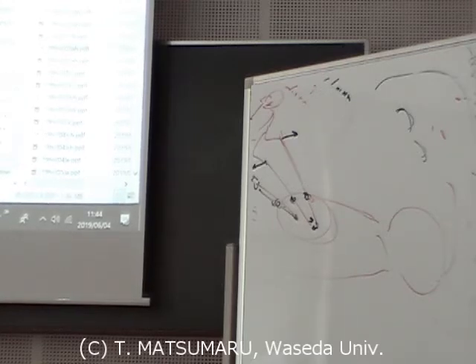It's the voice command, with no assistance. Usually an assistant or nurse operates the camera by the surgeon's voice command, but in this case the robot moves appropriately.